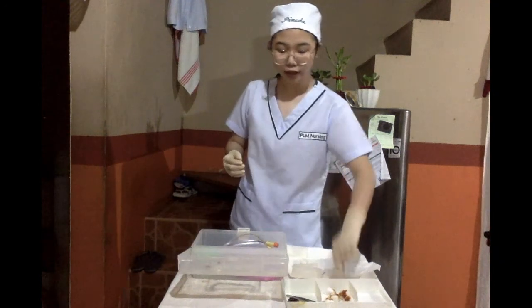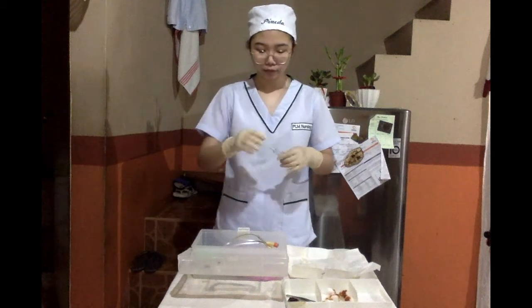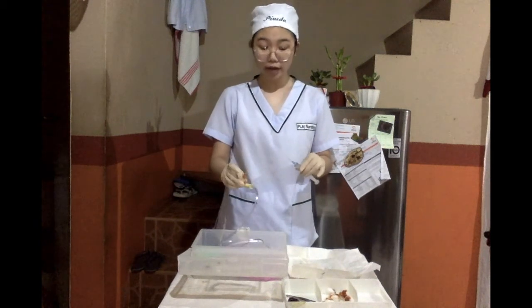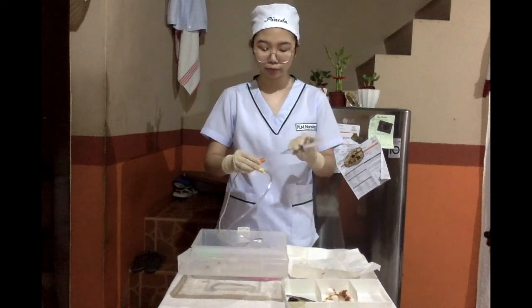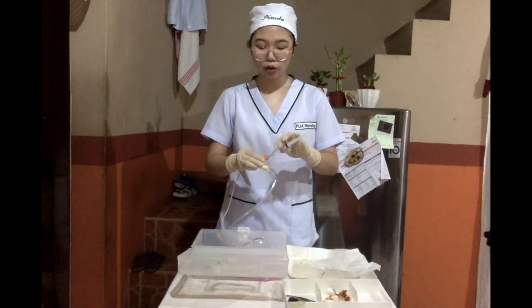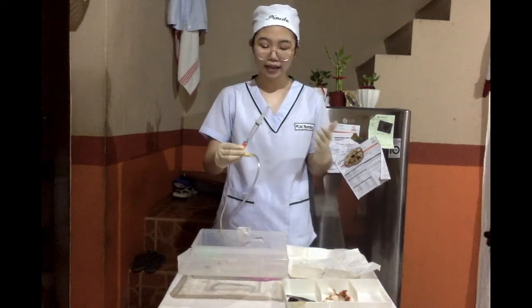Since we will be inserting an indwelling catheter, we will be attaching the pre-filled syringe of sterile water in the balloon port of the catheter. So the balloon port is rubberized. That's why we will be needing the needle of the syringe. And because of the revised guidelines, we will no longer be testing it, or we will no longer be doing the pre-inflation of the balloon.